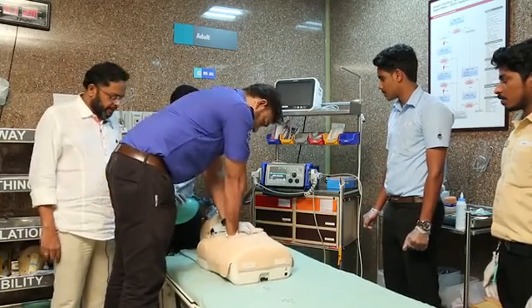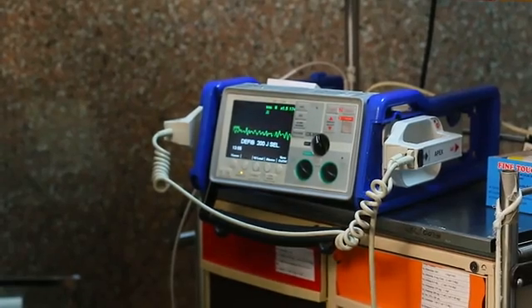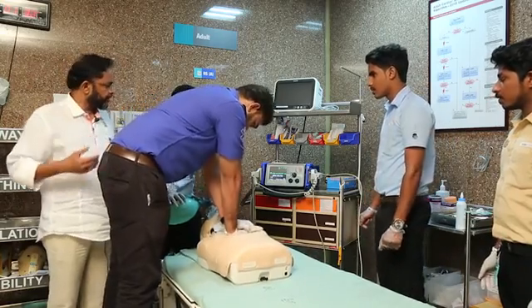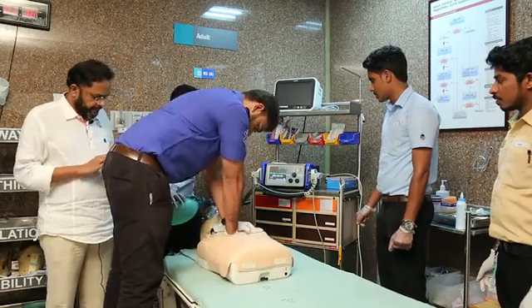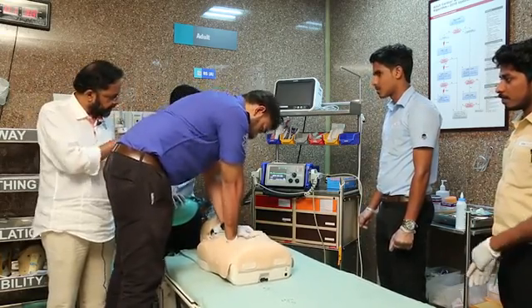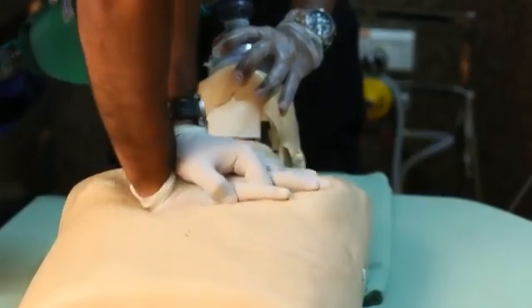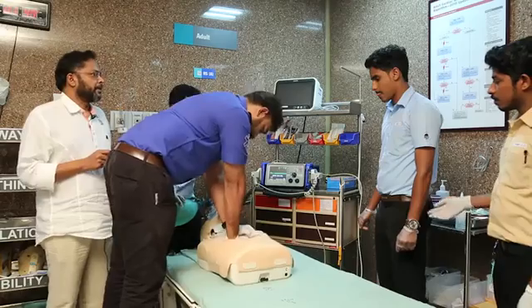Ventricular fibrillation is a situation which requires immediate and urgent defibrillation. We are moving to the process of defibrillation. There are two rhythms — one is VF, and another rhythm you can see is ventricular tachycardia. Both rhythms require urgent, immediate, emergency defibrillation.